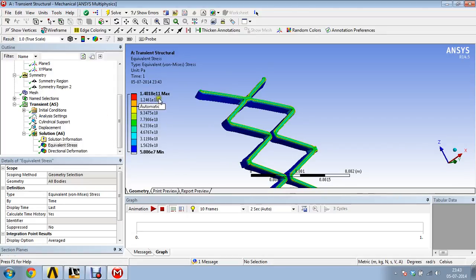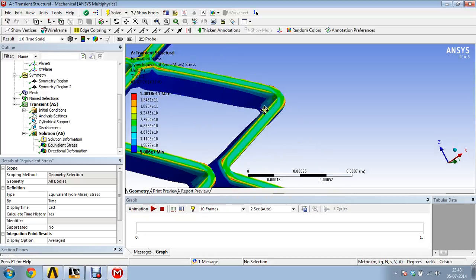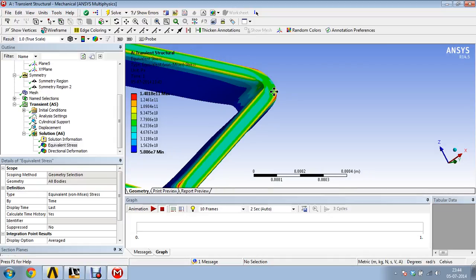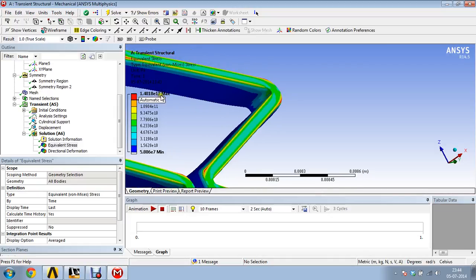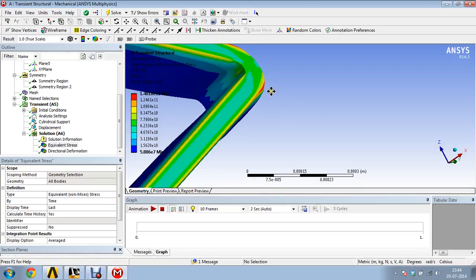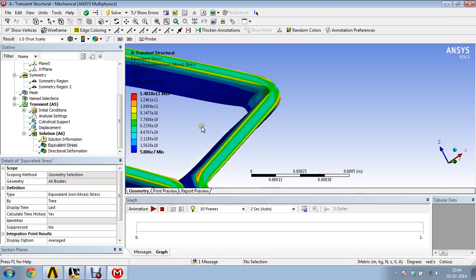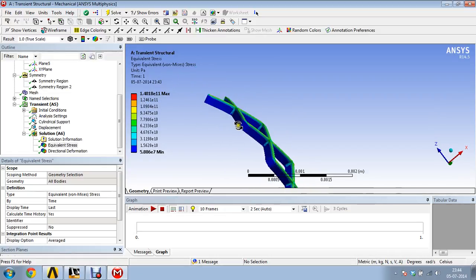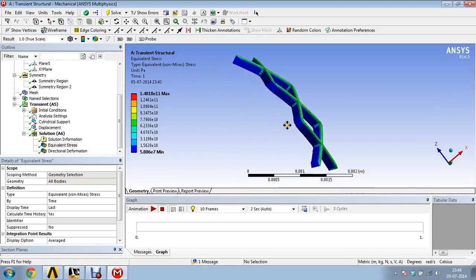But this stress is too high, and we need to look out, because this is compressed 1 mm. I think this is structural steel, and structural steel cannot be compressed 1 mm because this is beyond the ultimate tensile strength or yield strength. So it will fail at these portions, and permanent yielding will take place, so we need to look out. But this is a general FE analysis of how it will respond to particular pressures or displacements. Okay, so let us see how it simulates.